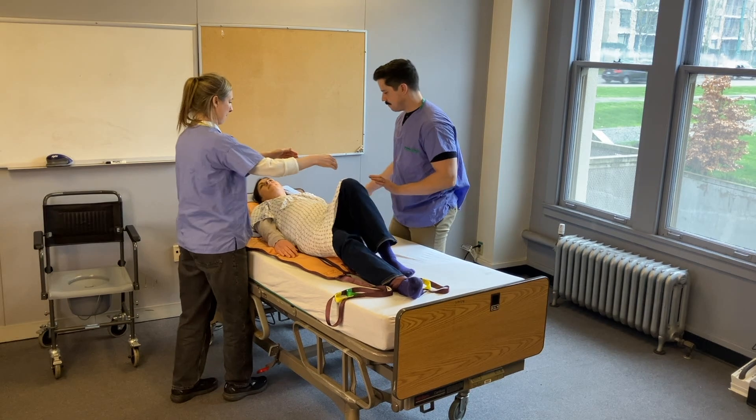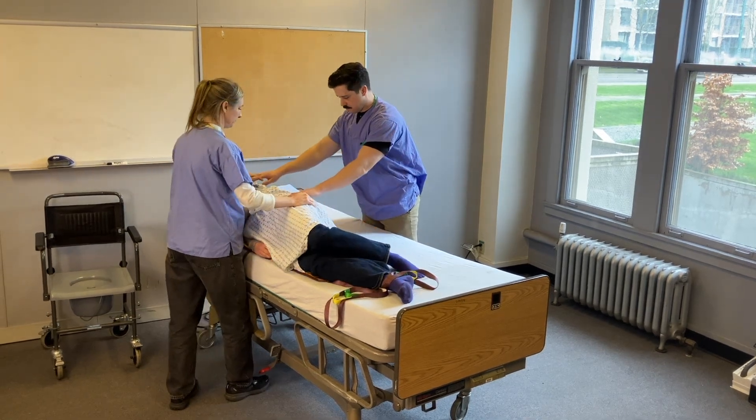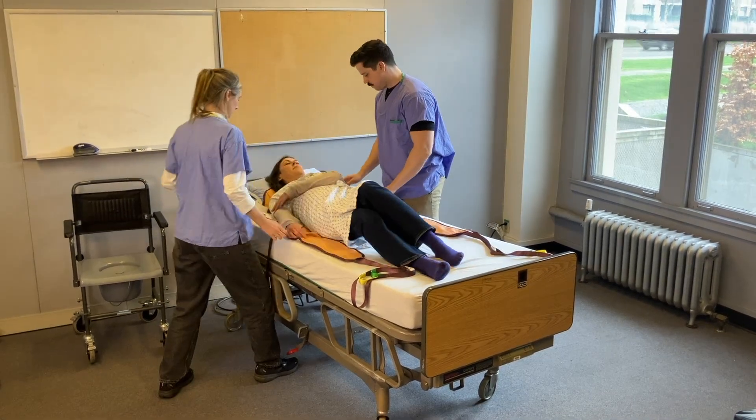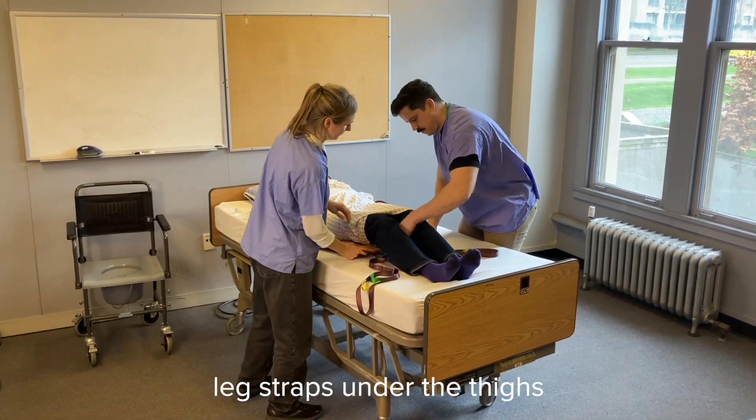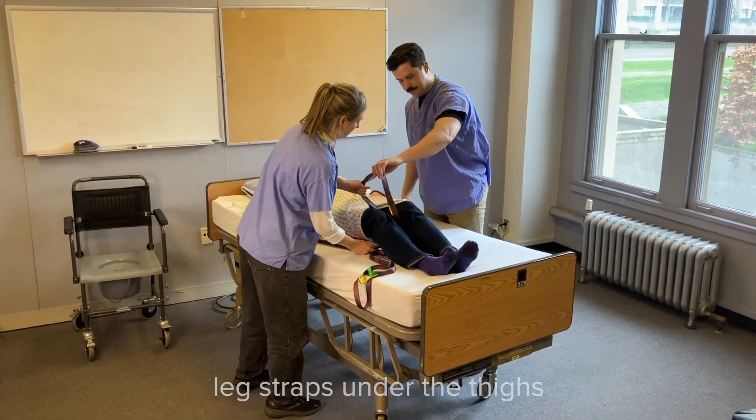The patient turns to the other side and the sling can be gently pulled through. Position the leg straps underneath the patient's thigh, making sure that the fabric is flat.